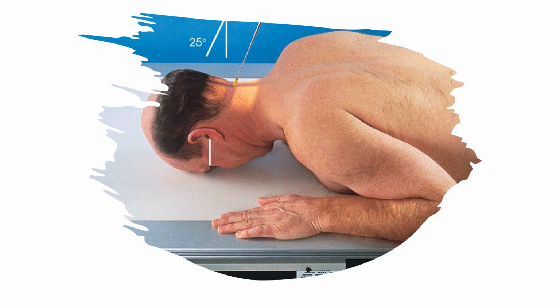The OML, the orbital meatal line, that's the white line connecting the EAM to the outer canthus of the eye. That's going to be perpendicular to your image receptor. And then your central ray is going to pass through a plane that intersects both EAMs. Okay?